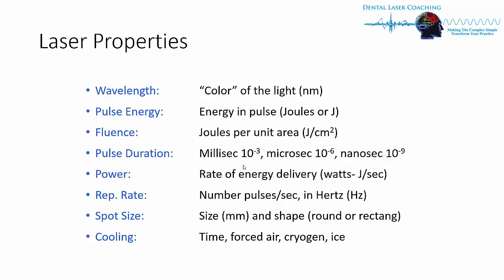And power is the energy that's delivered, usually in watts, which is calculated in joules per second. And then hertz is how the pulse is represented, the pulses per second.